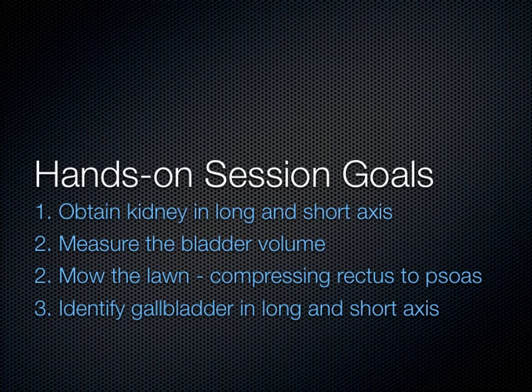It does something too with the lateral abdominal wall muscles maybe, brings those in a little bit tighter so you can use them for compressibility. Brings the contents of the abdominal cavity, the intestines, a little bit more anterior, so you're compressing anteriorly and not laterally, coming from the side. That's the only thing I can think of. I get that question all the time, and that's how I think of it. It just brings everything together a little tighter into the abdominal compartment.